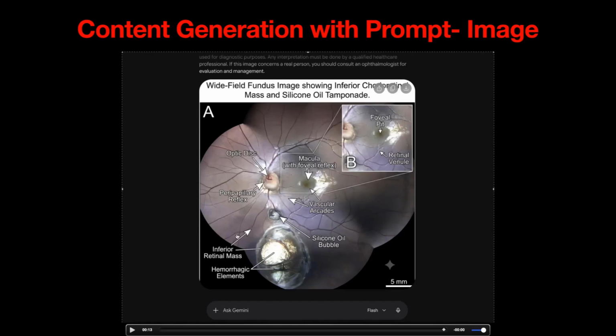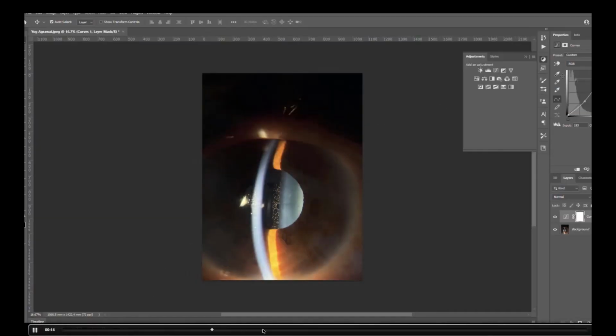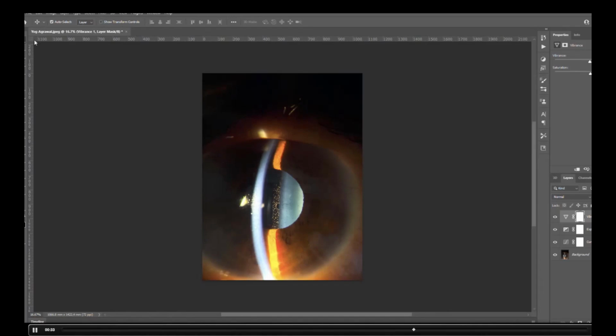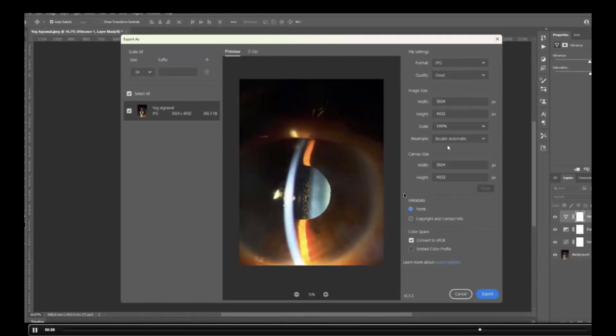And at the end, what you get out of it is a good image with a lot of markings like this, which we used to do previously, and it saves a lot of time when you go into your publication journey. So again, this is one of the anterior segment images, where I'm just forwarding it. Only when you forward these will you know what it was and what it is actually becoming, because of the pre and post edit, with a lot of layers or prompts that you give, and how it really enhances itself. So this is the end image of it.